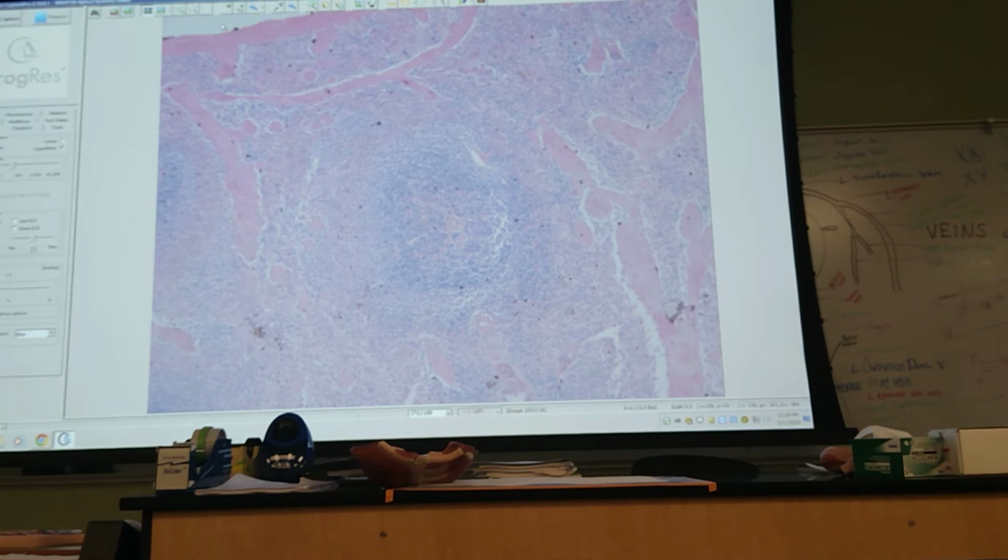Okay? In the one case, the part that's part of your defense immune system, these are called splenic nodules, splenic corpuscles, or just white pulp. Even though they're not white at all when they're stained. Go figure, as they say.